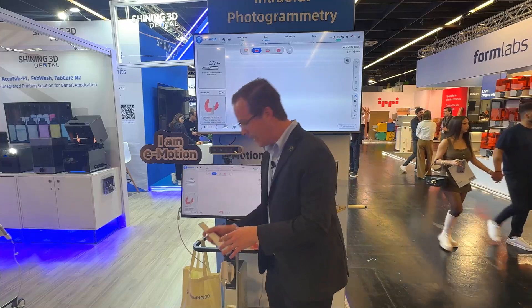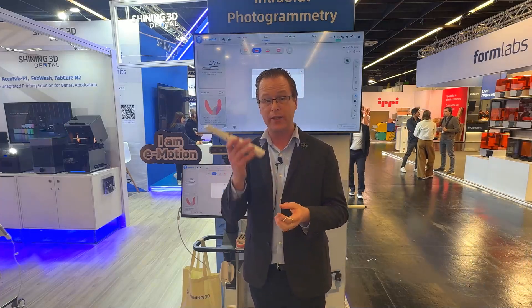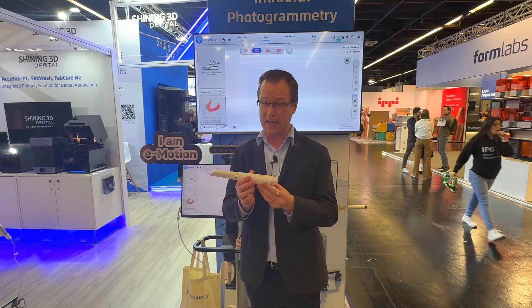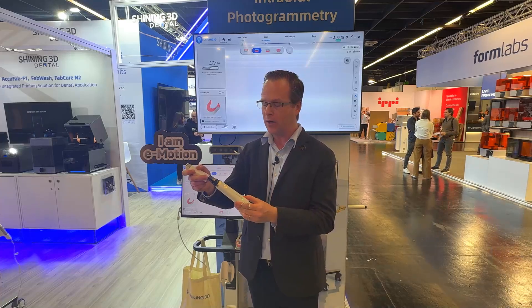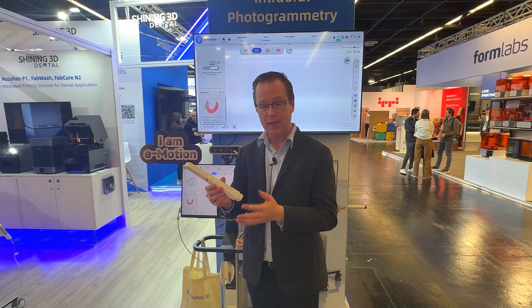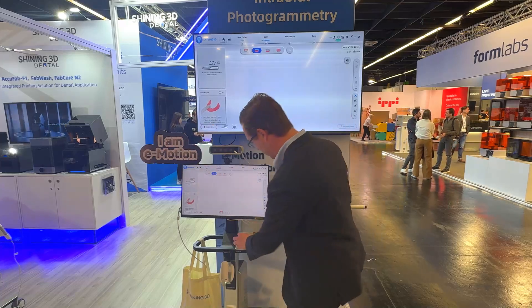I've got the scanner here — you can see it's just under 200 grams, feeling very light. It's a little heavier than the Shining 3D Elite scanner with a cord, and that's required because it has a battery in place. As I pop the tip out, you can see the optics right in here. I can only put this on one way so I don't have to worry about it. The green light pops on indicating when it's ready to scan, and it feels very natural in my fingers.